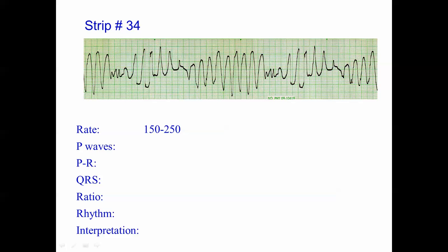If we look at the QRS complexes, for example, and find one that falls on a dark line, the next one is greater than five millimeters away. So if you saw a rhythm in which the QRS complexes were fewer than five millimeters apart, you're probably looking at ventricular fibrillation rather than torsade de pointes. I've made that mistake in the past.